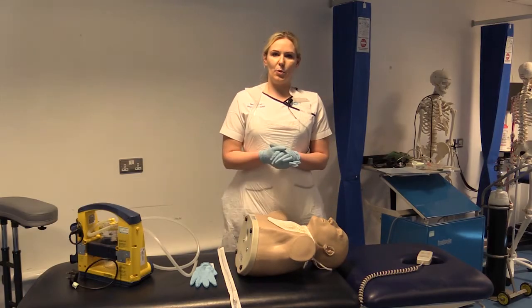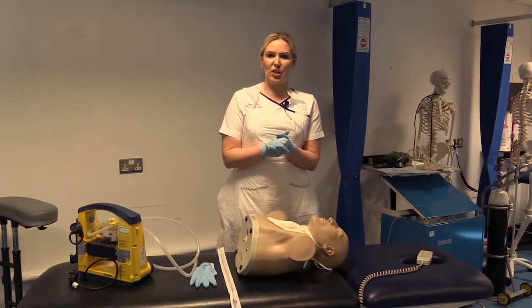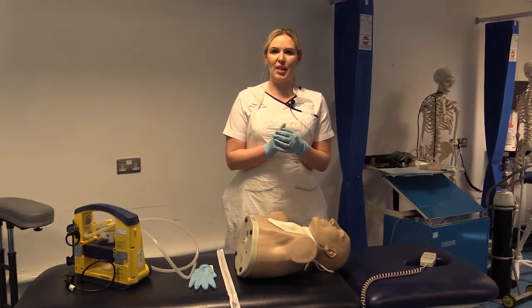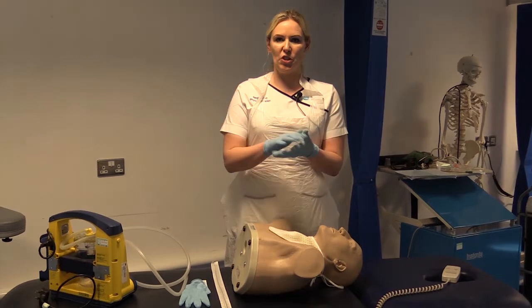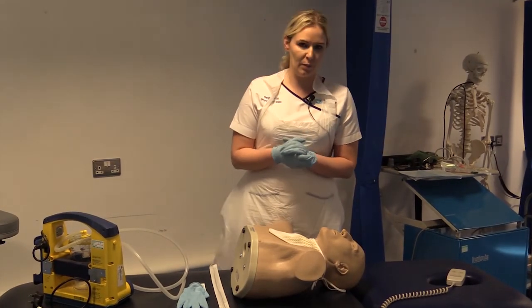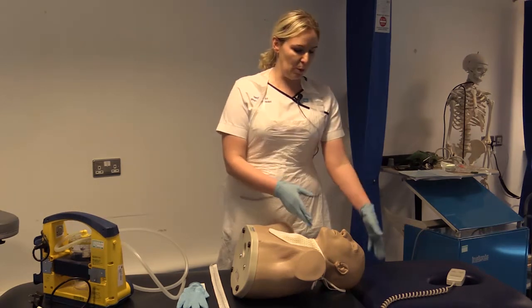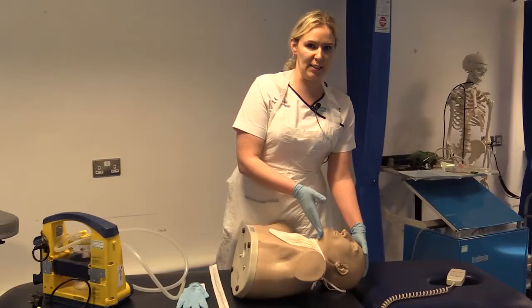Okay, so this first video we're looking at nasopharyngeal suction. So obviously you've established your need for suction, you have gained informed consent where possible, and you have checked the patient's medical notes. Okay, so prior to going in, you're going to wash your hands and put on your appropriate PPE. You're going to explain to your patient what you're going to do. You're going to position your patient appropriately so their airway is as open as possible with their chin pointing upwards and their head tilted back.